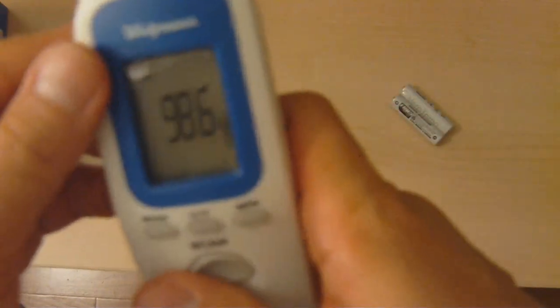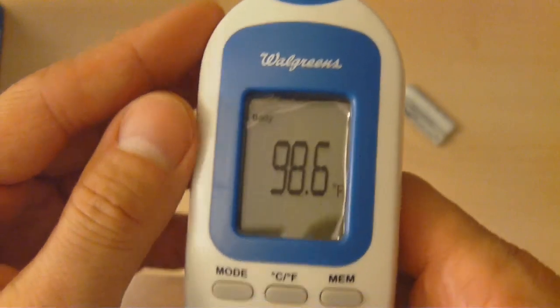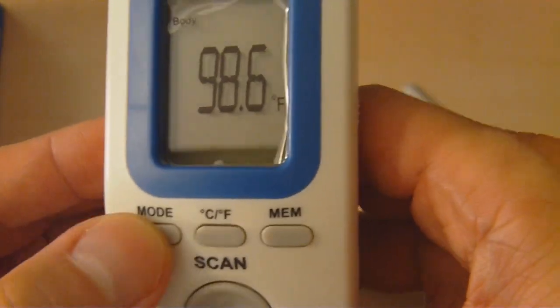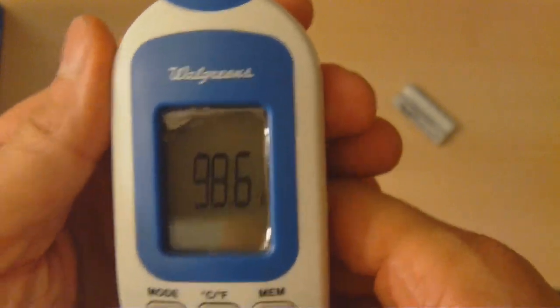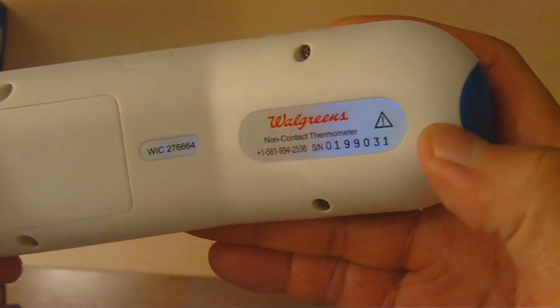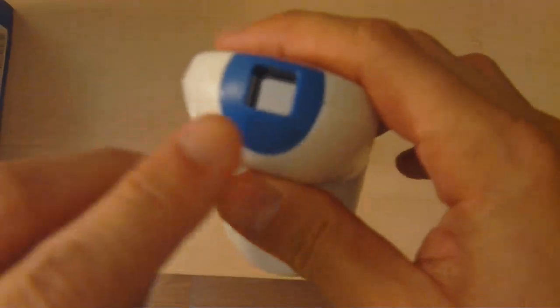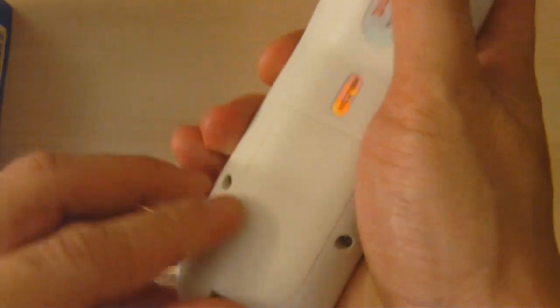Looking at the thermometer, there's a little sticker here — it's not really reading 98.6 right now because it's not even turned on. There appears to be a speaker hole, the mode button is here, and the buttons feel stiff — feels like it's going to last. On the other side we see the battery compartment, a Walgreens label with a serial number, it says 'non-contact thermometer,' and here is the infrared sensor.